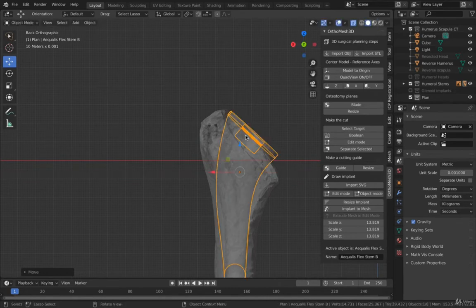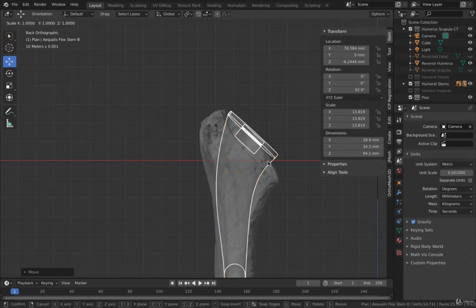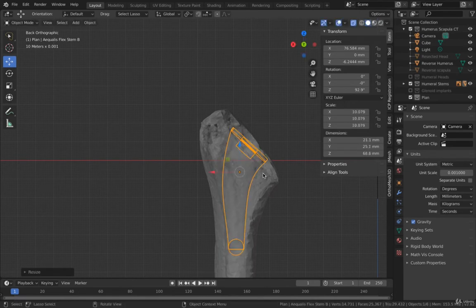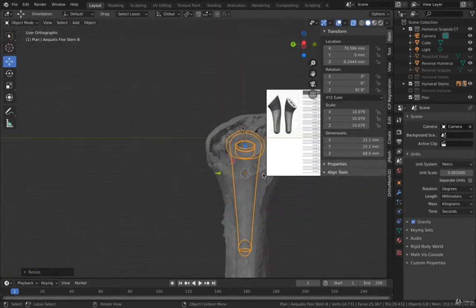We have too big of a stem, so we're going to go under item. We can see the size of the stem is 94. That's on the very large size. With the stem selected, I press S on the keyboard and I scale it down so I have a good fit with the endosteal canal. And that's a pretty good position, I think, of the stem.